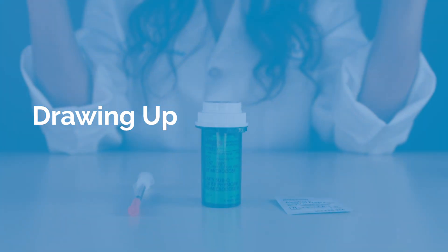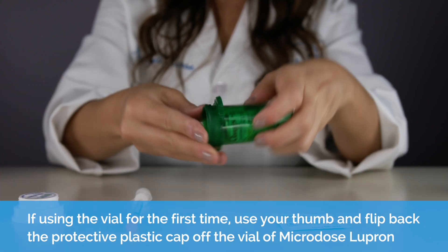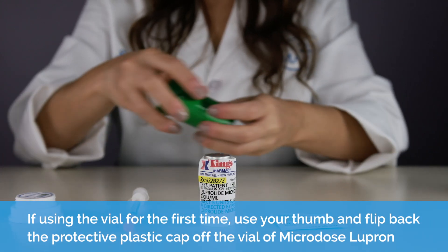Drawing up. If using the vial for the first time, using your thumb, flip the protective plastic cap off the vial.